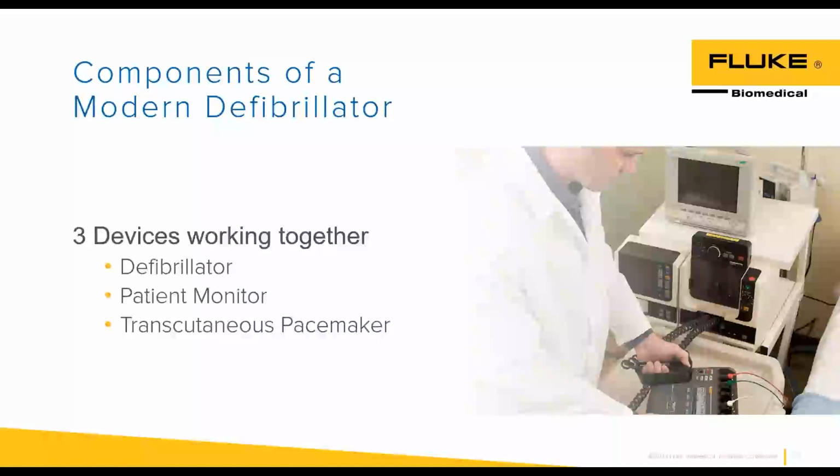But if you want to do a cardioversion, you had to slide them together. And on the very top of that black box with the knob on it, that was the pacer, and it was an option. You could buy the defibrillator with the monitor, and then buy the pacer later on, and it slid into the top. So the old school ones would literally just say defibrillator. Then I remember working on the LifePak 9s that said monitor defibrillator. And then there's LifePak 9Ps, or monitor defibrillator pacemaker.